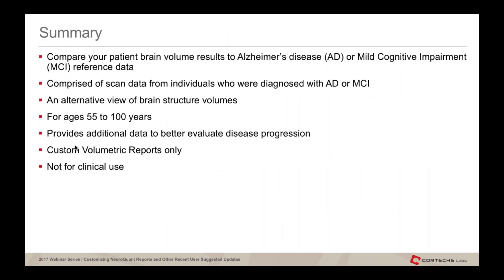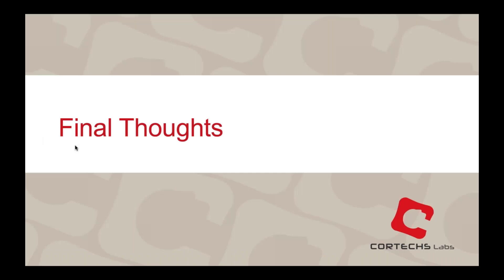The second alternative is the Alzheimer's disease reference data. For a different subject with even more severe hippocampal atrophy (total, left, and right) and increased inferolateral ventricles, running with the Alzheimer's disease reference data shows values much more centered in what is considered normal for that reference dataset. The hippocampus values move from the red area in the normative charts to the central white area of the Alzheimer's disease reference data. This is for clinical research only, not currently for clinical use, and is limited to ages 55 to 100.